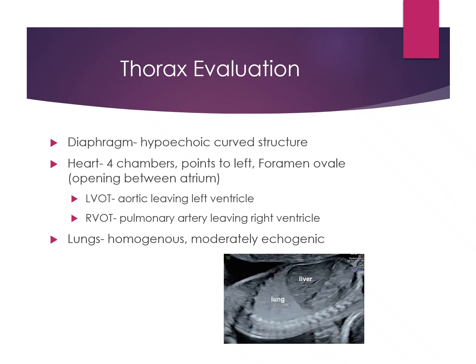Moving into the thorax evaluation. Again, these all hang together. I'm going to break the heart down because it doesn't hang together and you really have to do a dedicated scan for the heart. But the lungs and the diaphragm hang out together. So we know that superiorly the lungs sit above the diaphragm. And the diaphragm is that really big, thick muscle that separates the thoracic from the abdominal cavity.